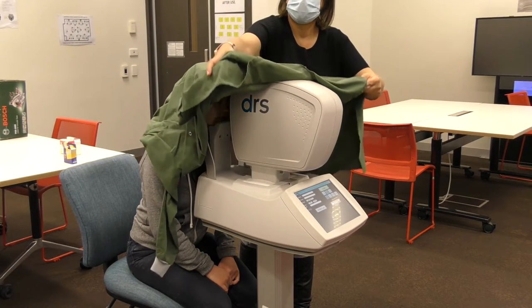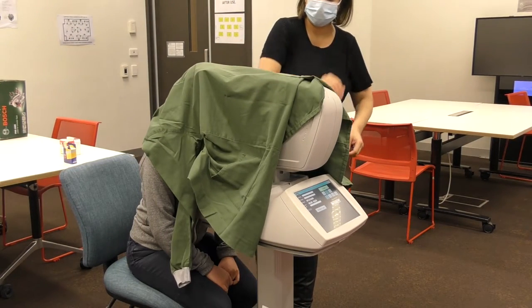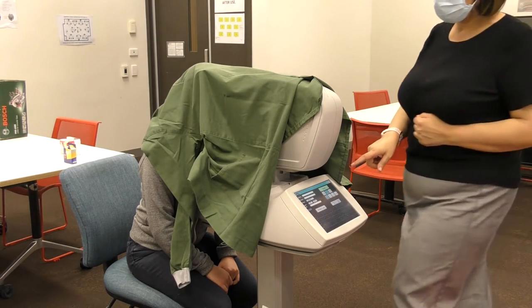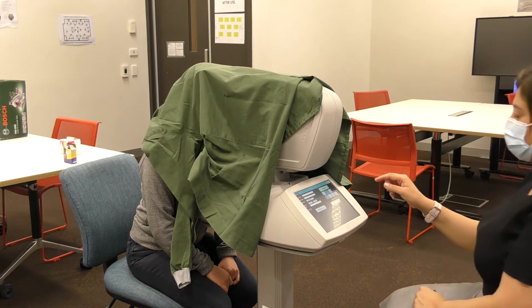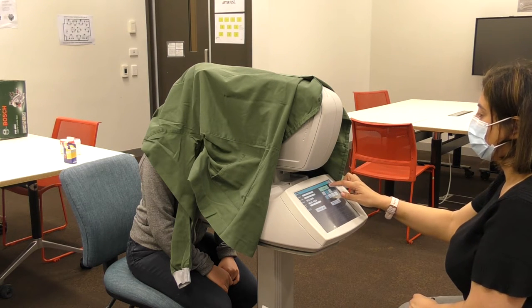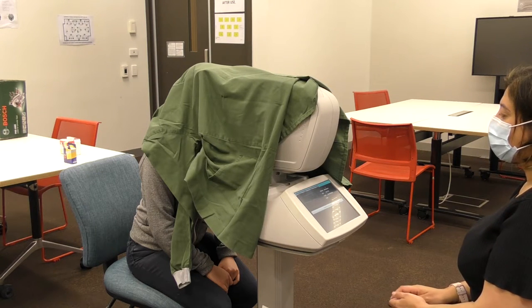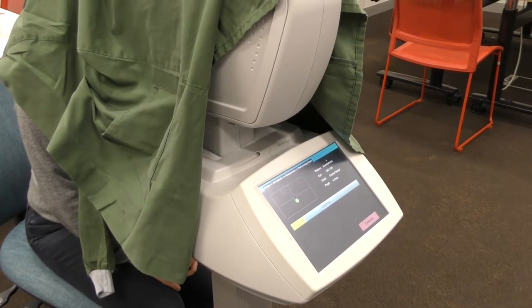You can see a cover being placed over the subject's head, which cuts out extraneous light from the classroom and allows the pupils to dilate for a better picture. The whole system is automated, so once you press start the machine will automatically find each eye, focus correctly on the retina, and take a picture.